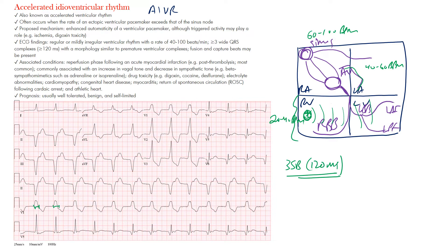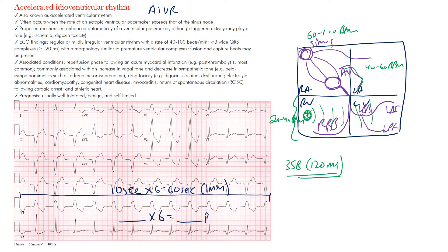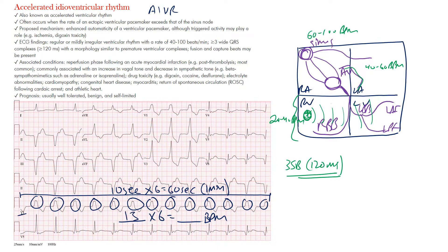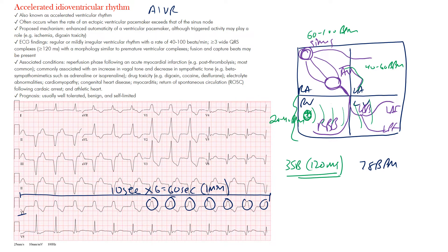To find the rate on a standard 12-lead EKG, we know the strip is 10 seconds. Multiplying by 6 gives us 60 seconds, so counting the complexes and multiplying by 6 gives beats per minute. Counting here: 1, 2, 3, 4, 5, 6, 7, 8, 9, 10, 11, 12, maybe 13 — 13 times 6 is about 78 beats per minute.